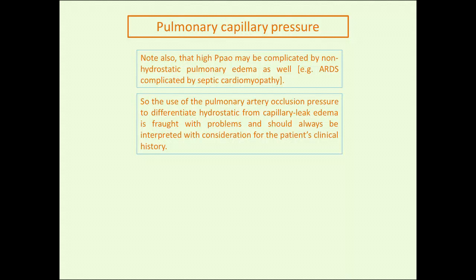And that is, thank you for paying attention for a whole 40 minutes. That is my diatribe on the pulmonary artery occlusion pressure. It is probably my least favorite number from the pulmonary artery catheter.